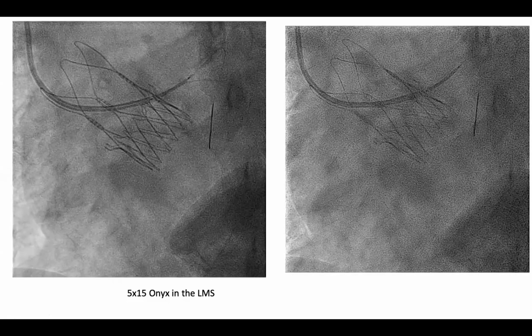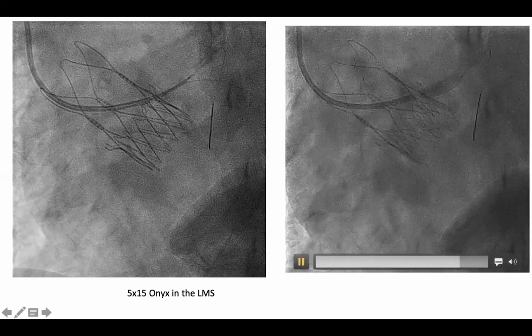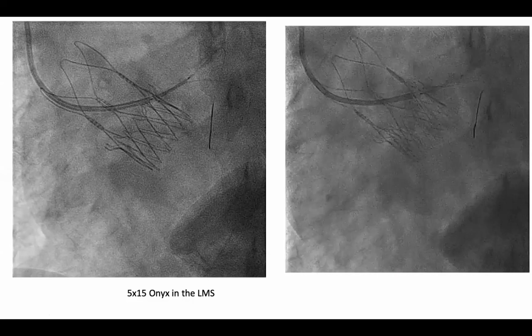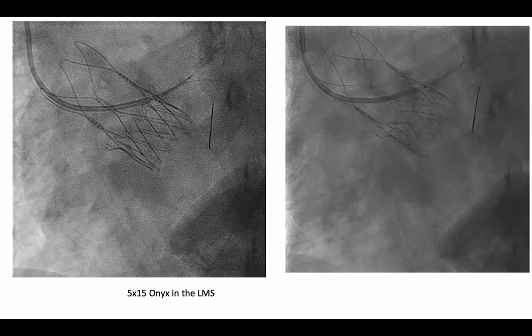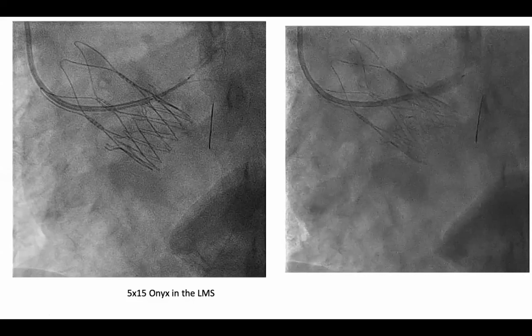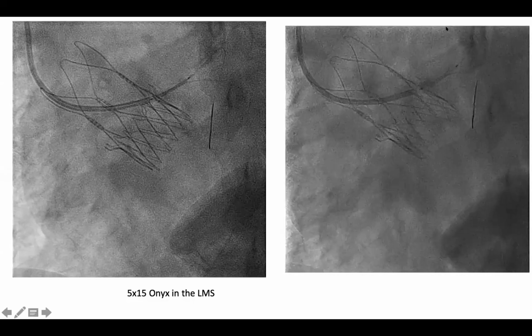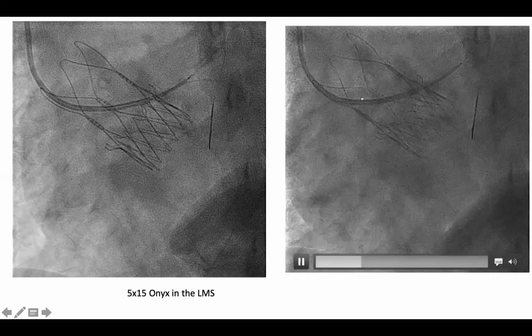Yeah, I mean, cranial is generally a very good view to see where you need to deploy. But here you have got another hard landmark as well, where the aortic wall is. Yes, the valve is in the aorta. Yes. But there is sometimes, Javed bhai, distance between the TAVI valve and the aorta, so we can get misled. Yeah, because that's a very important thing, knowing exactly which valve this one is will help, because the valve shapes, the shapes of these skirts and things, are different for different valves.